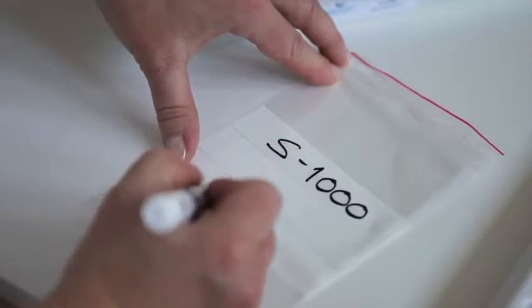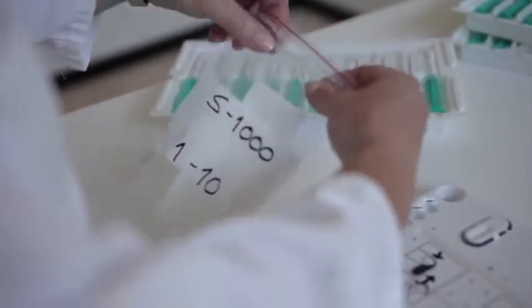Mark the plastic bag with the name of the series. The preloaded chambers can be stored for up to 14 days if they are stored in a refrigerator.